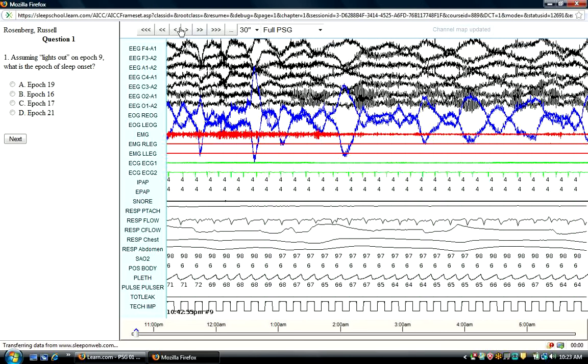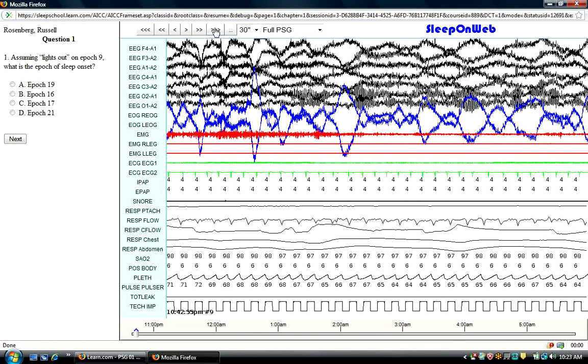I'd like to also orient you to these buttons up here in the upper left-hand corner, which will advance the study one way or another. If you go to the triple arrows, you'll go to the very end of the study, the triple arrows pointing to the right, triple arrows to the left, take you to the very beginning of the study.